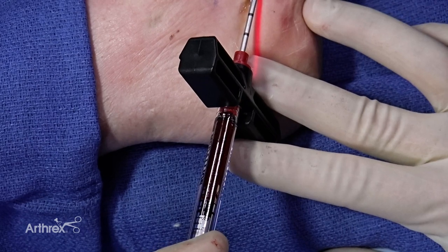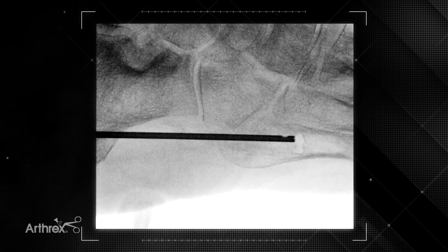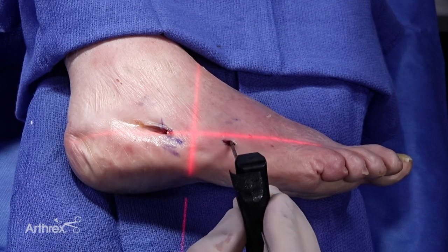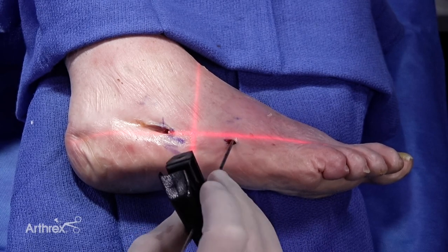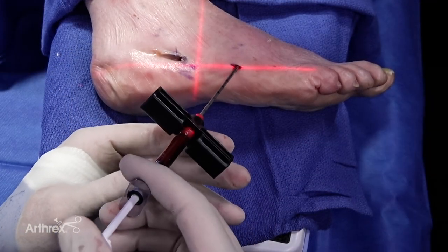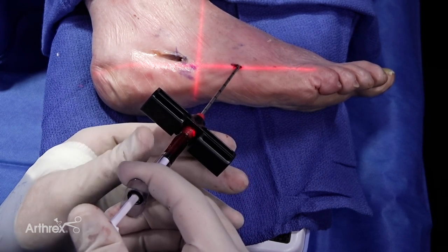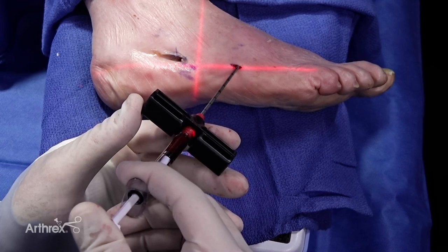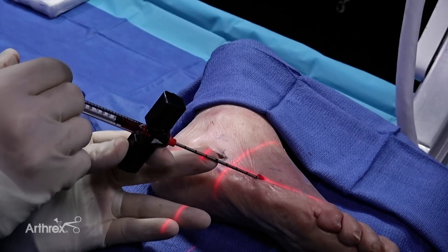Make sure that just distal, at, and just proximal to the fracture you're adding a small amount of graft. You do not want to add too much volume at this point because you still have to place your screw. Similarly, in the subperiosteal space created previously, place the Tuohy needle, remove the obturator, and then add graft subperiosteally all around the fracture site — plantarly, laterally, and dorsally.